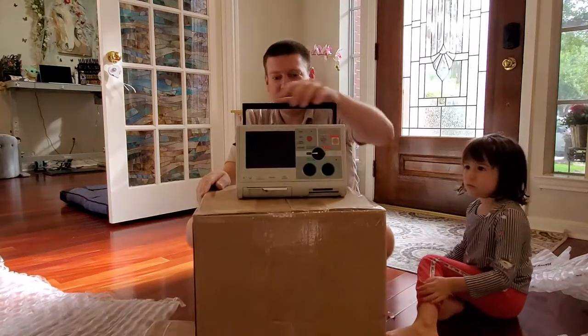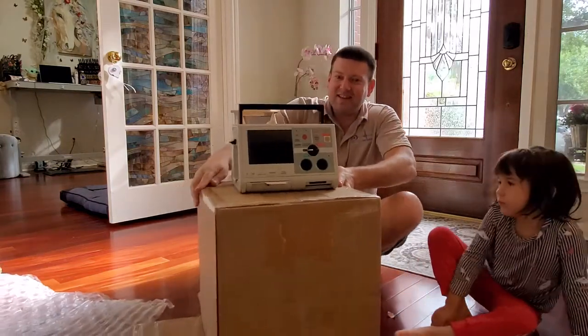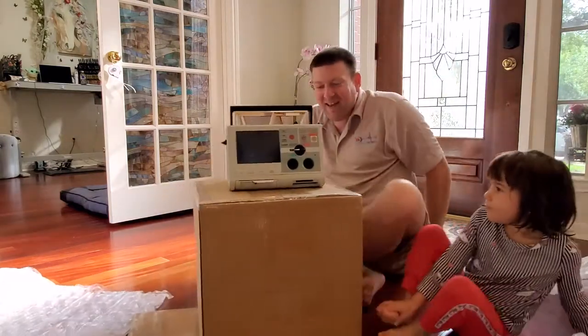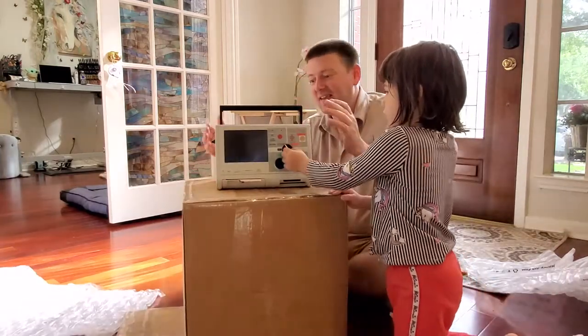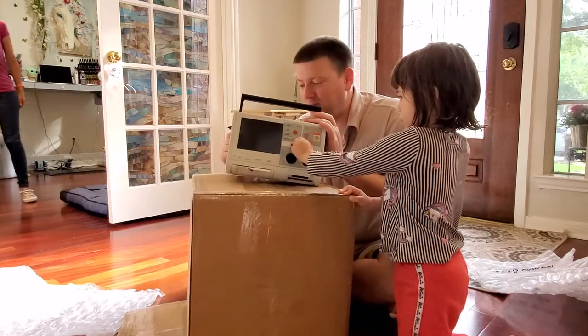Oh my gosh — isn't that a beauty? Take a look at it. Oh my gosh, it's a Zoll M Series! This guy looks like it is completely loaded.